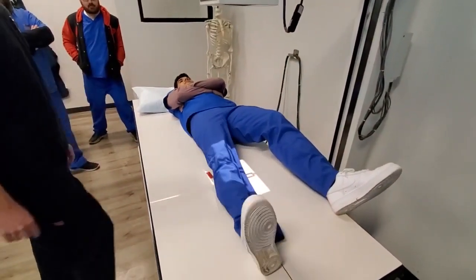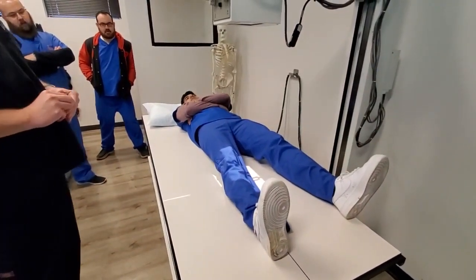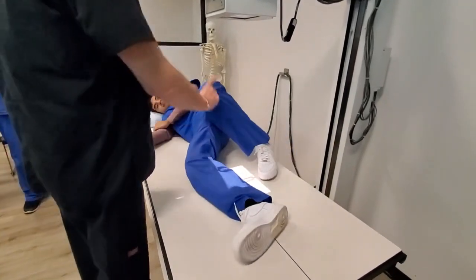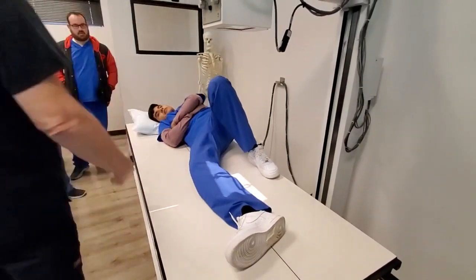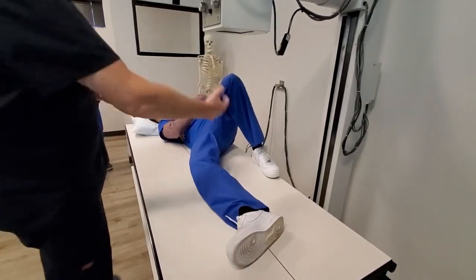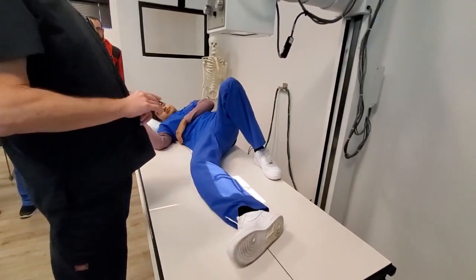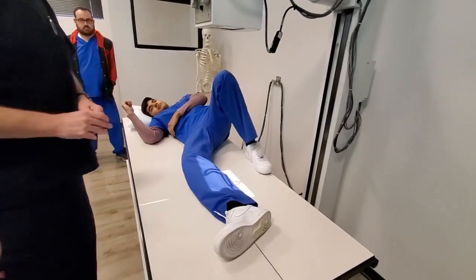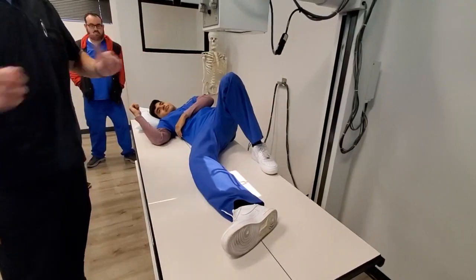Go ahead and relax your leg. What's next? Lateral. What type of lateral do we do? Mediolateral. Patient, let me have you roll to your right side for me. Where do we want the unaffected leg — bring it over or keep it behind? We don't want it on top because we'll wind up over-rotating the hips and the body part. Do we have an angle for this one? Yes — five to seven degrees cephalic. We're going to put five degrees on for this patient.